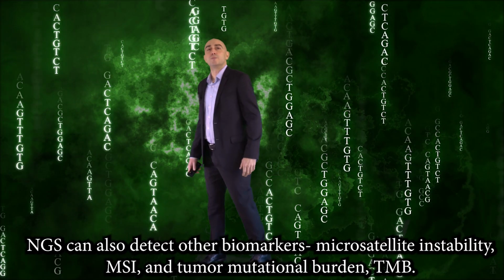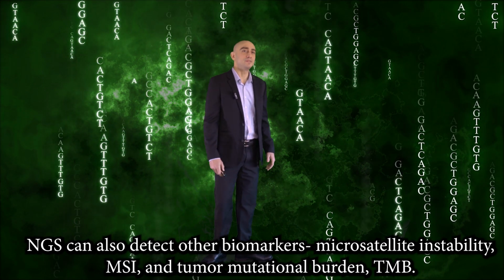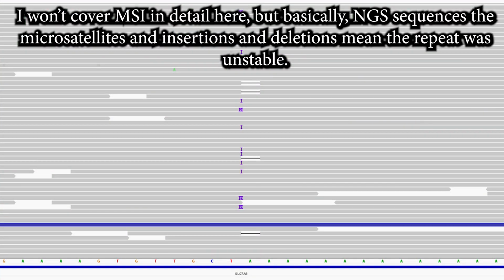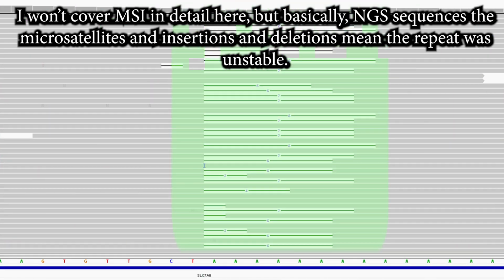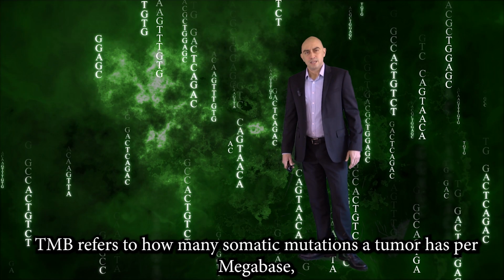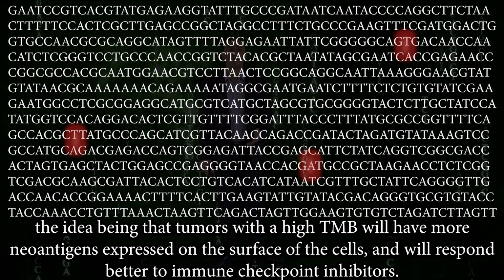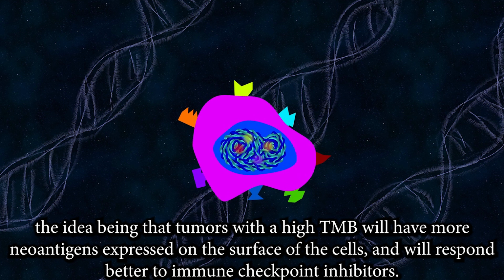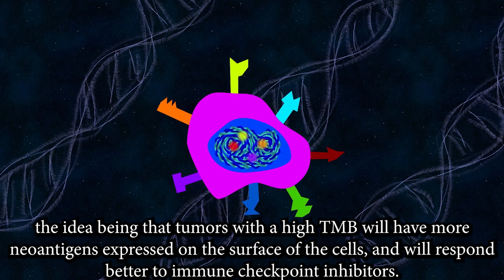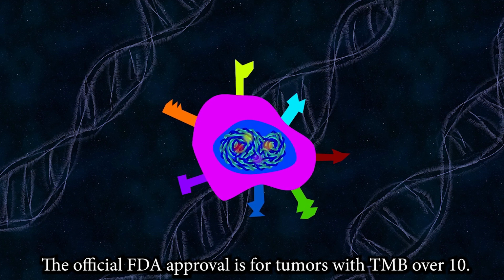NGS can also detect other biomarkers, microsatellite instability, MSI, and tumor mutational burden, TMB. I won't cover MSI in detail here, but basically, NGS sequences the microsatellites, and insertions and deletions mean the repeat was unstable. TMB refers to how many somatic mutations a tumor has per megabase. The idea being that tumors with high TMB will have more neoantigens expressed on the surface of the cells and will respond better to immune checkpoint inhibitors. The official FDA approval is for tumors with TMB over 10.